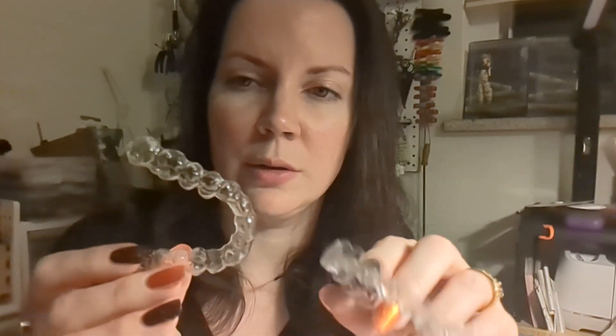So I have new tray number two. Just as a comparison, my first tray and my current one — I know you can't see this on camera because it's super subtle. The first ones were just starting to get really slightly discolored, I think.